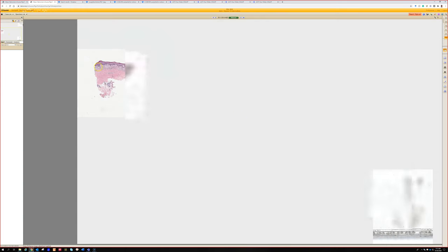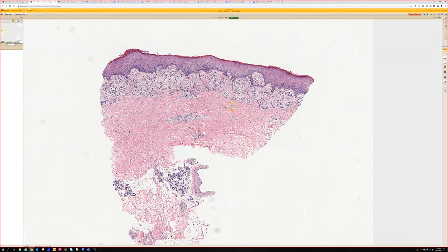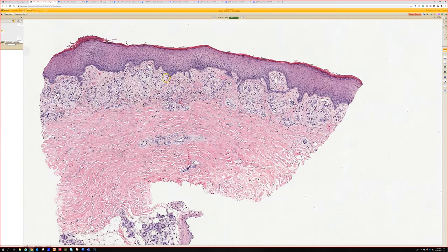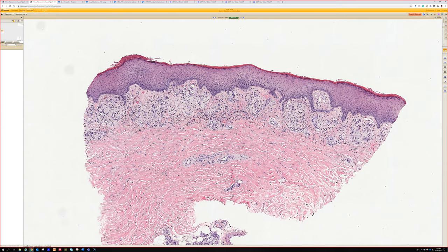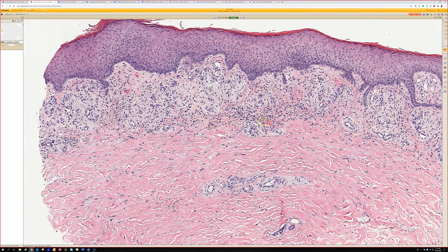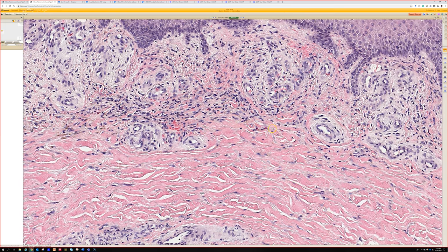Number five. We have a small bleeding punch biopsy. In the upper reticular dermis, there are a lot of these dilated, cannonball-like vessels. They're a little much, there's no more fibrin. There's a lot of red cell extravasation in some areas, and hemosiderin too, so probably a chronic process. Not a ton of inflammation for a segmented pattern — so probably just a venous stasis type picture.